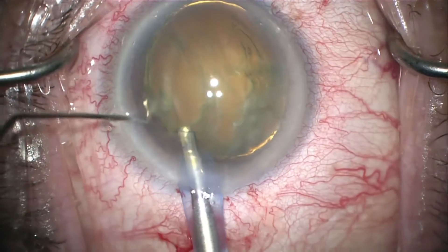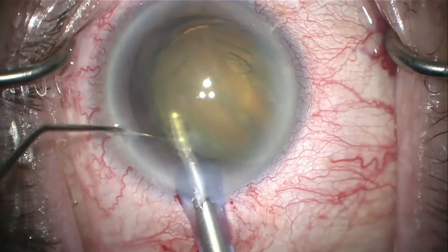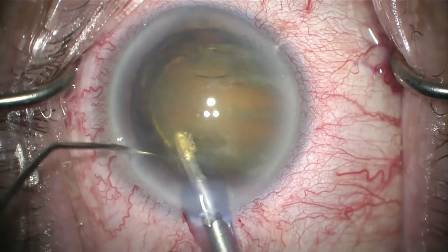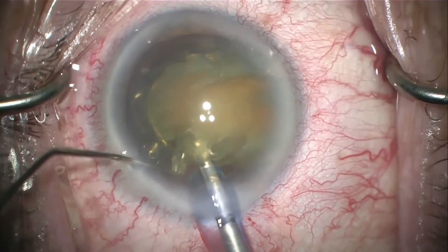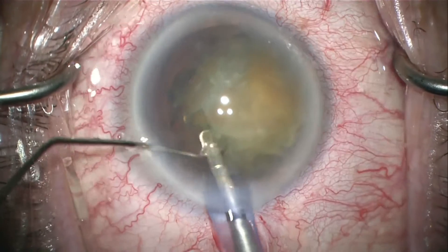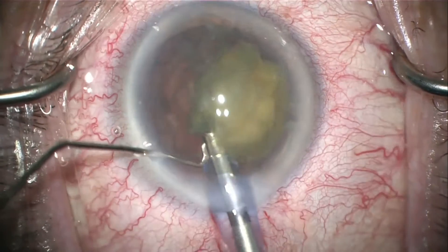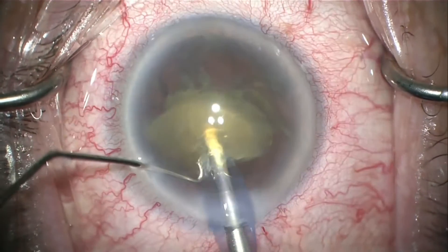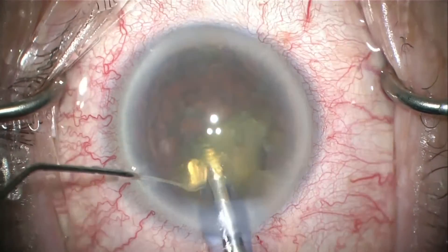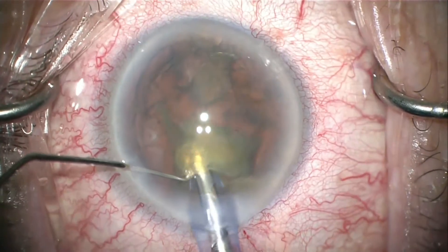I'll bring the lens forward towards my phaco emulsification tip. Using my FACO II fluidics — in this case the Venturi — I'm able to emulsify the lens as one large quadrant. The Ellipse FX uses a combination of longitudinal as well as side-to-side motion to achieve excellent phaco holdability. You can see how the lens stays stuck to the tip and is emulsified very efficiently.